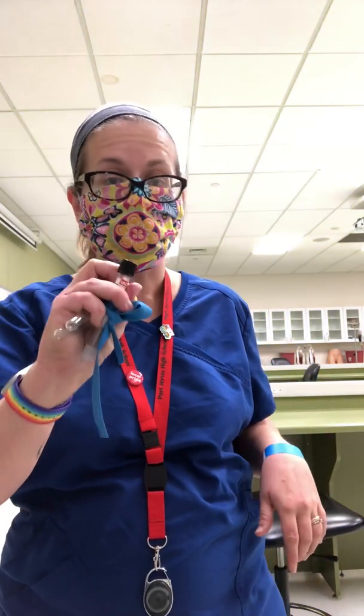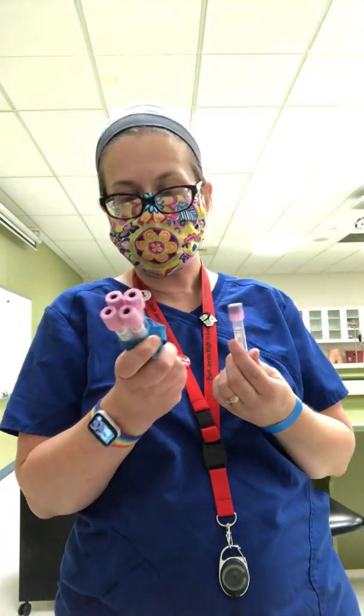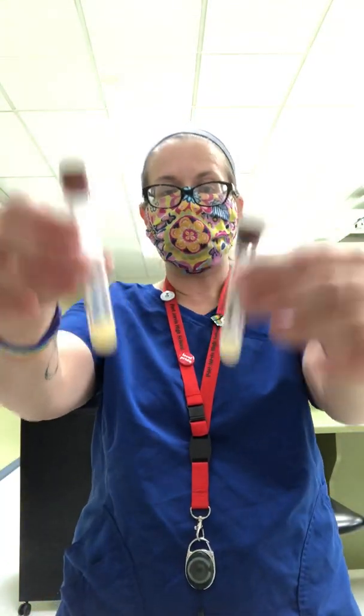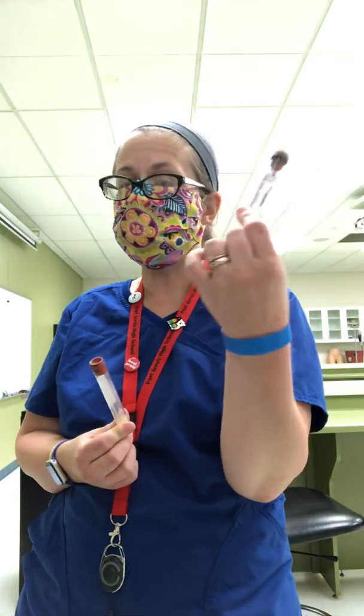After gray, it doesn't matter what order you draw the remaining tubes. If you have a dark blue or navy blue, you draw it then — that's for lead levels and heavy metal levels. Pink is the same as lavender; they both have EDTA in them, so if you run out of lavender tubes you can use a pink in place of it. Usually pink is drawn for a blood bank specimen — type and crossmatch, type and screen. Also, tube size doesn't necessarily matter. A small speckled and a big speckled have the same additive and can be used interchangeably; use bigger ones when more tests are ordered.